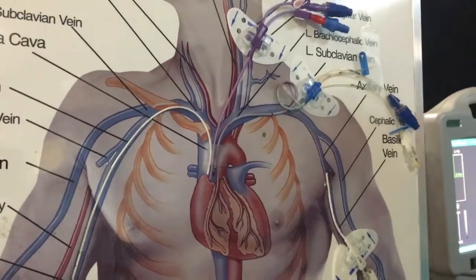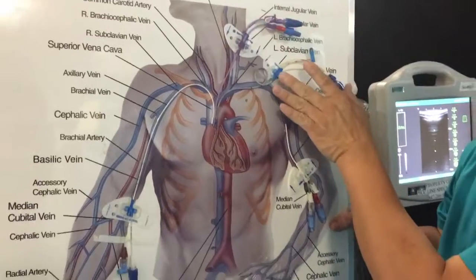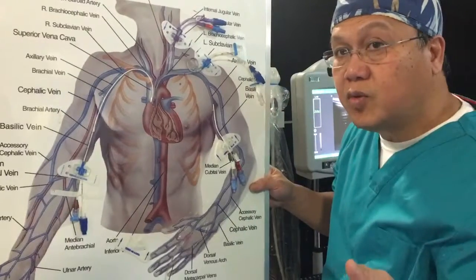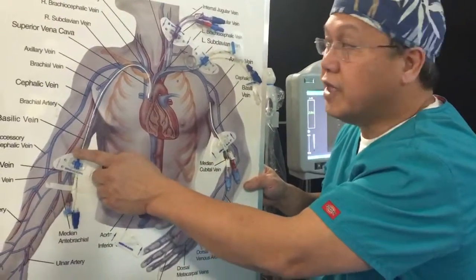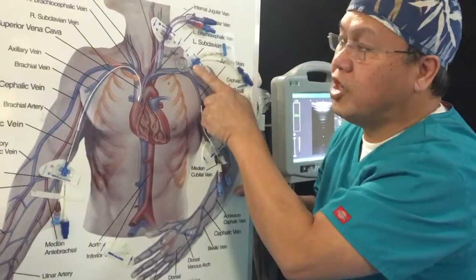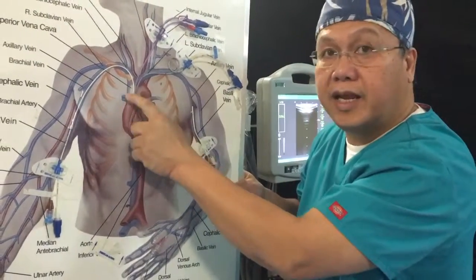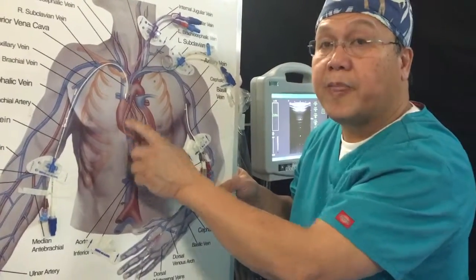So to summarize, a PICC line, a jugular central line, and a subclavian approach central lines are all central lines. What defines what a central line is not where it's inserted, in this case the upper arm, the neck, and the chest, but rather where the tip of this catheter ends, which is the distal end of the superior vena cava to the cava atrial junction.